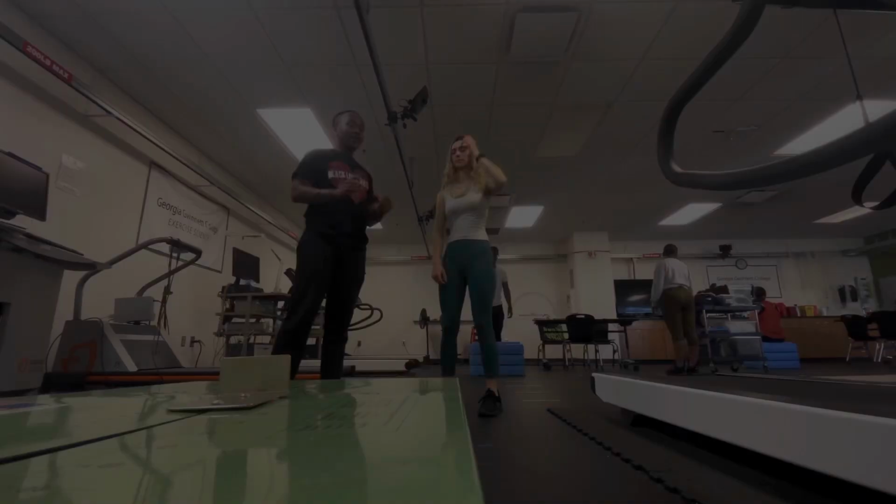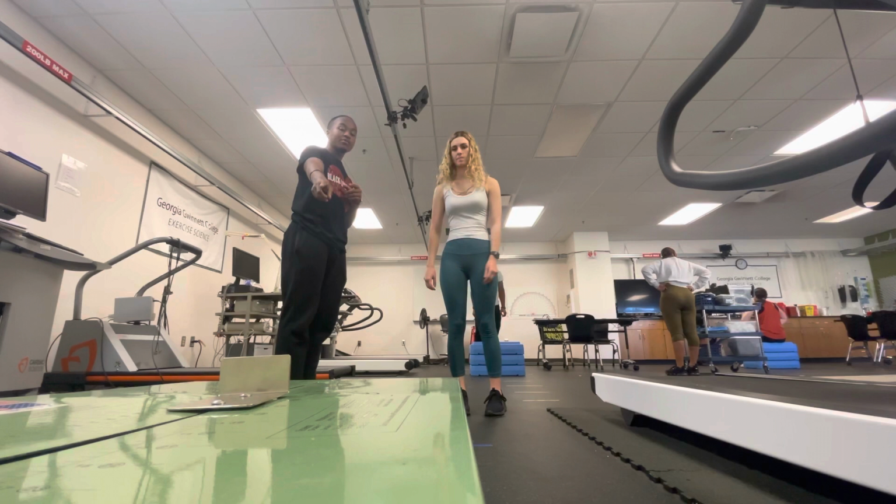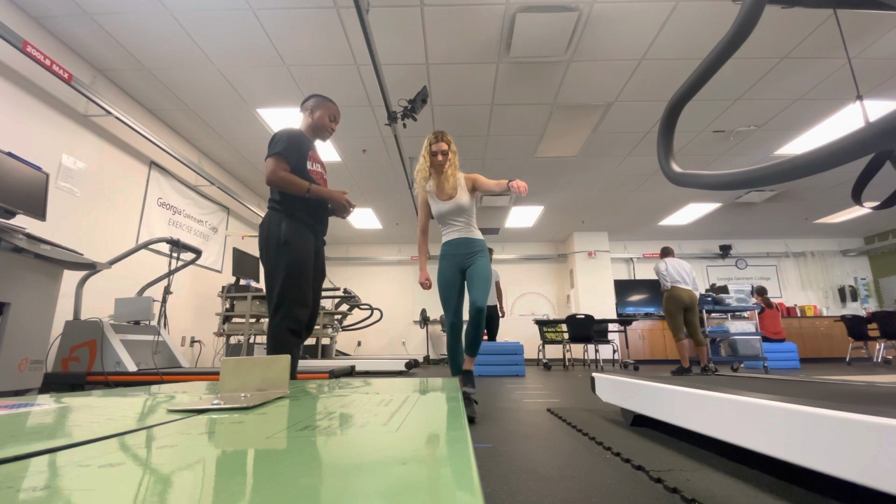All right, so today we're going to be doing a flexibility test. How we do this, we're going to measure you by doing a traditional sit and reach. That means we're going to take our shoes off, put your feet in this green box, and then reach out as far as we can. We're going to hold it for 2 seconds. And then that's when we get your measure for your flexibility, okay? So first, we're going to start with you taking your shoes off.